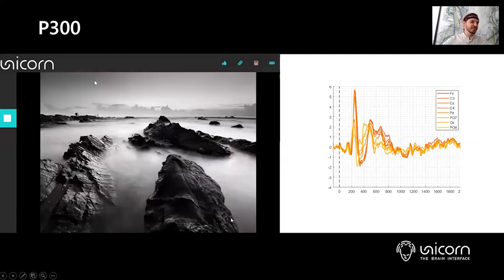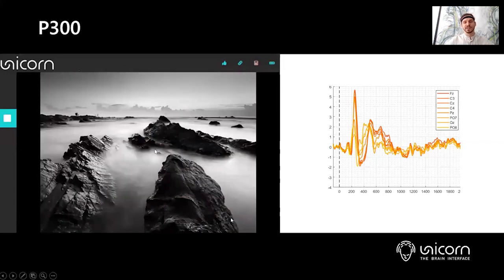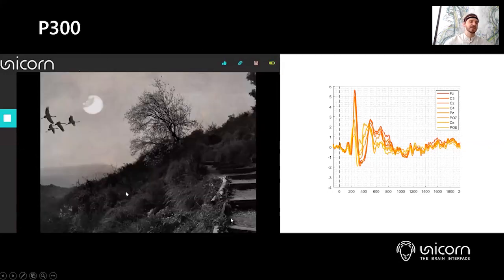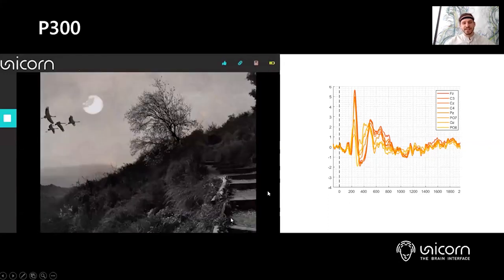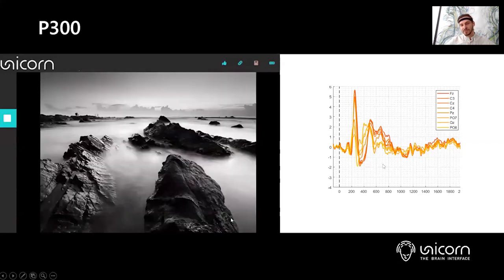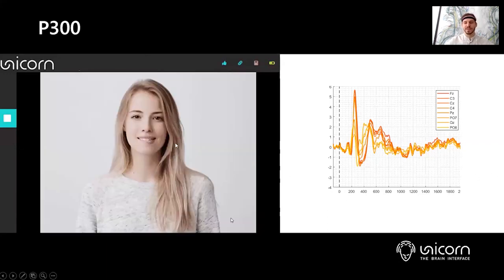And we're using this visual evoked potential for the Blondie check, for instance. This is the neuromarketing application. Here you can see that there are a couple of different images flashing. And there's one image with a blonde lady. And on the right-hand side, you can see the signals that are triggered with this paradigm.